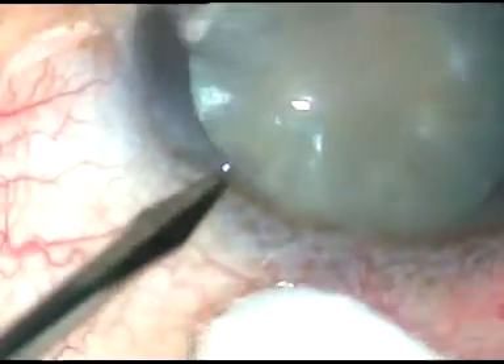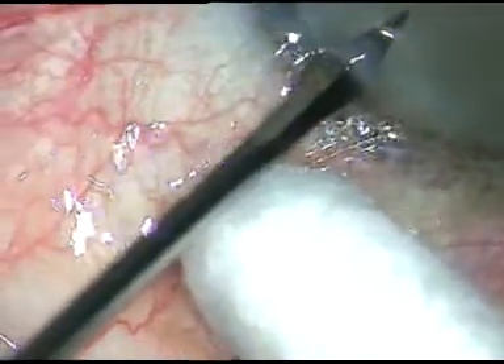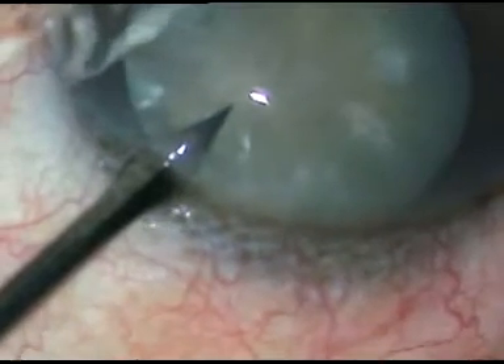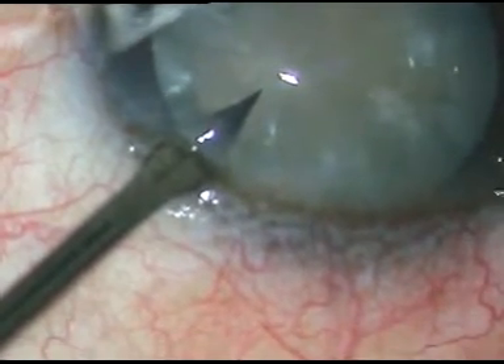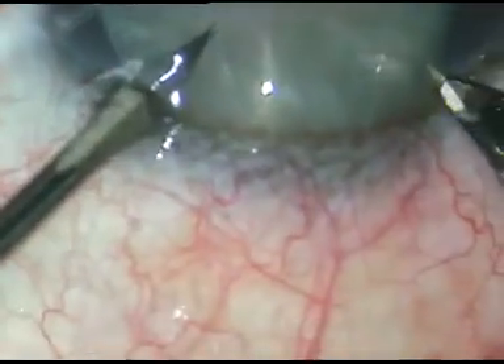Dear colleagues, this is phacoemulsification of an intumescent cataract. The side port has been made. Now this is the main incision. It is a 2.8 millimeter incision.